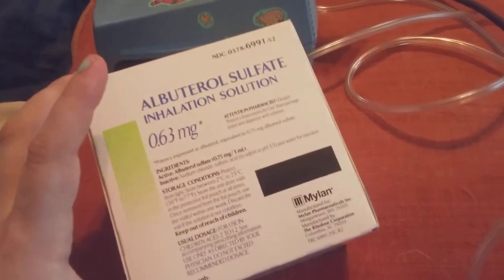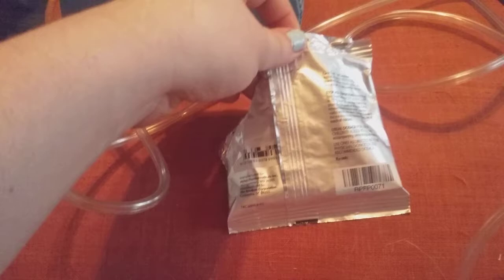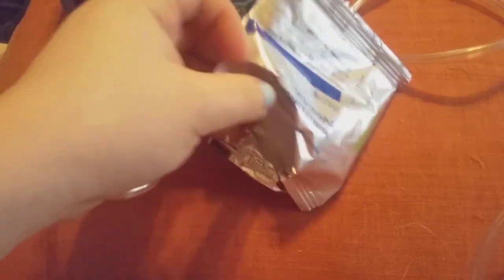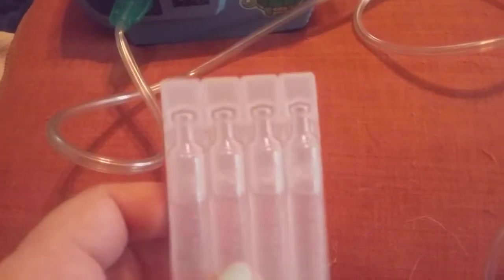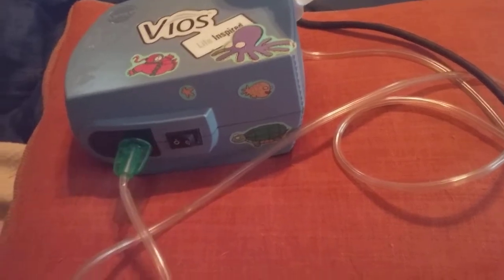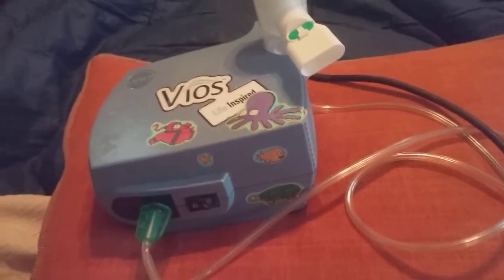Your solution comes in a box like this. My levalbuterol is 0.63 milligrams. What you do is you tear open one of these packs — they come in these foil packs. Your levalbuterol solution will look like one of these. You only take one of these off at a time, unscrew it, and then you slide it into your thing. Turn your machine on after you plug it in and you start your breathing treatment.